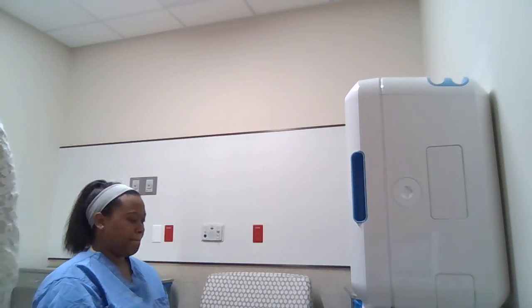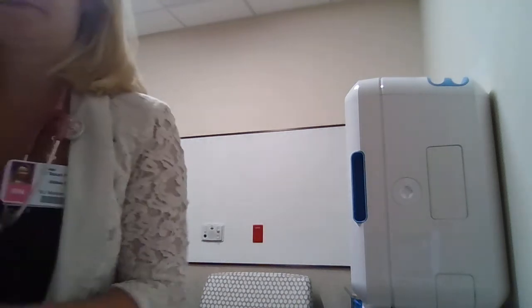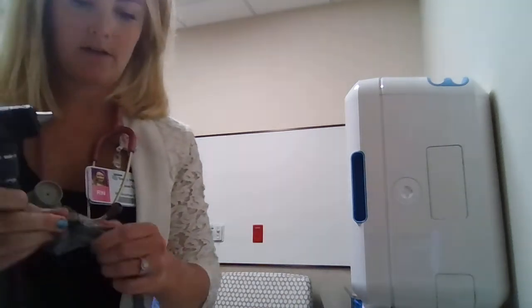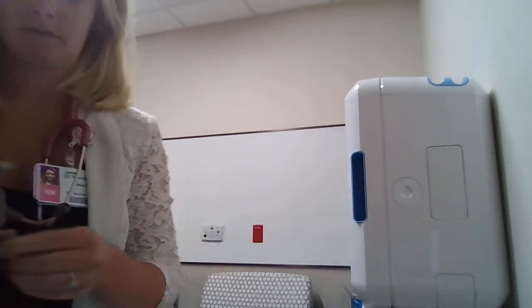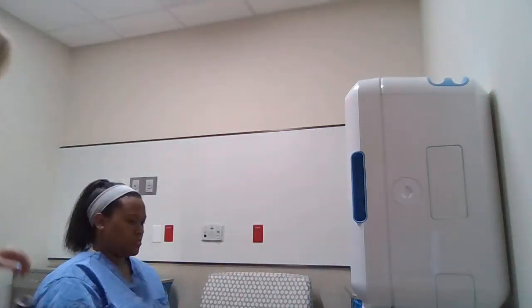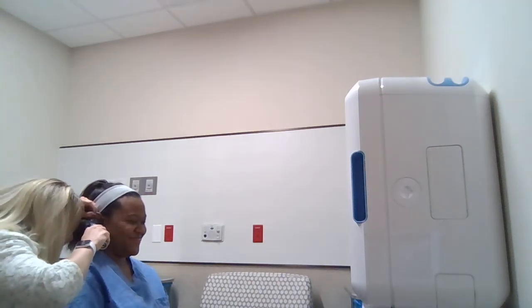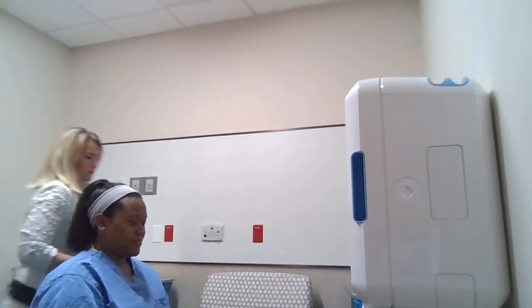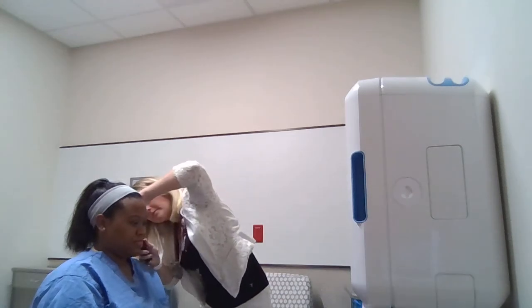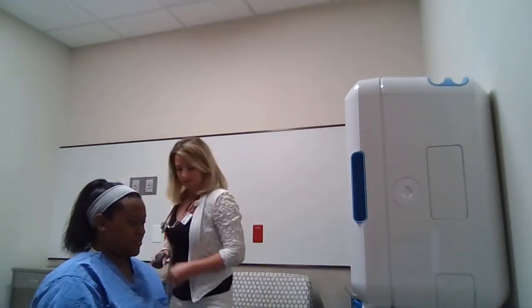Gonna go ahead and look in your ear with my otoscope here, and then your nose, and then your mouth, and then we should be done with the exam. Sounds good. Put a fresh cover on. Tympanic membrane looks good. There's no wax buildup. Alrighty, perfect. Thank you. All right, let's look in your nose.